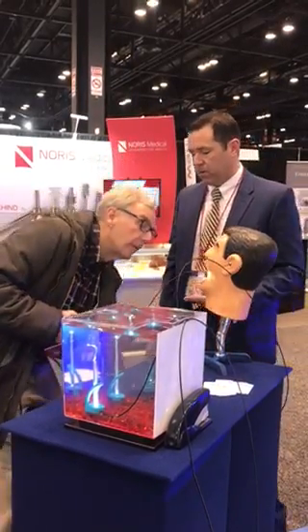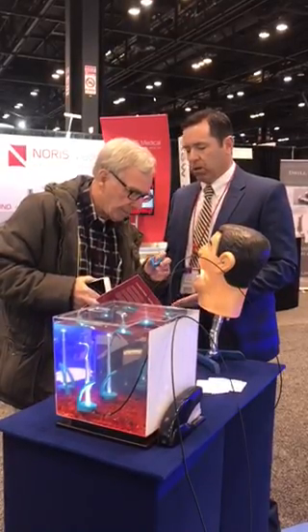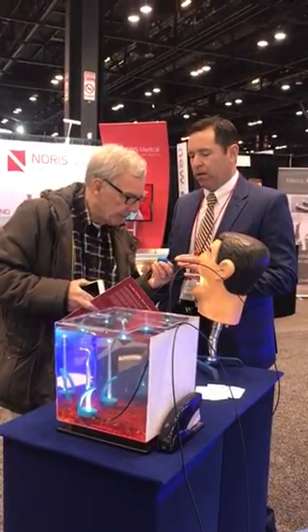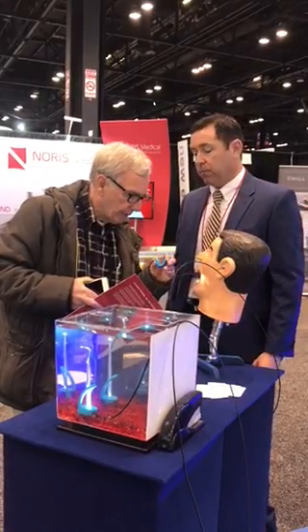It's actually Lexan. We use medical grade polycarbonate Lexan. As you know from an engineering standpoint, Lexan is made at 500 degrees. The injection mold is at 500 degrees, so that's some tough material.